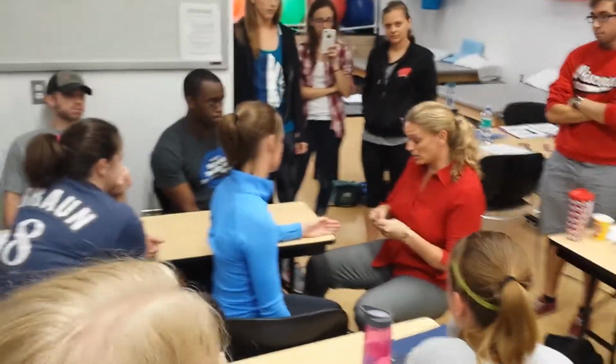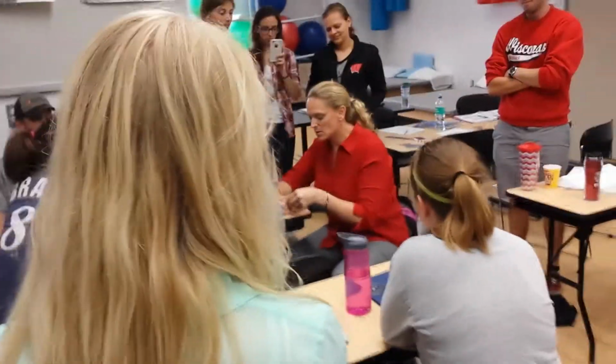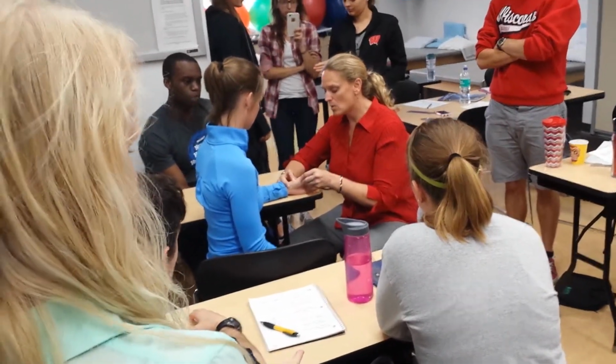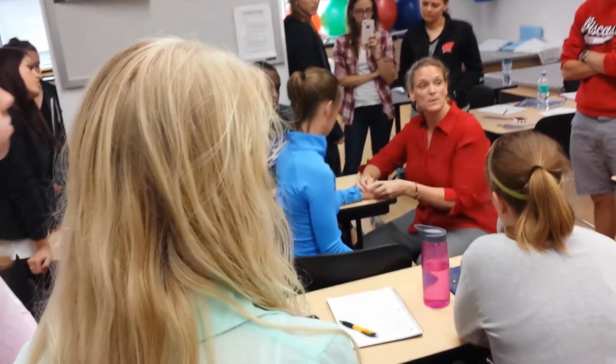That much ever. And that, maybe I should measure it. So again, the abduction is going to be this motion, and I'm measuring the CMC joint. Okay? And so if I'm going to do it passively, I'm going to take her, and that's really a soft tissue end feel. It's really her web space that's limiting me the most in that motion.